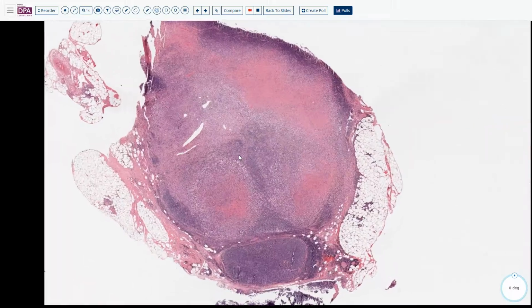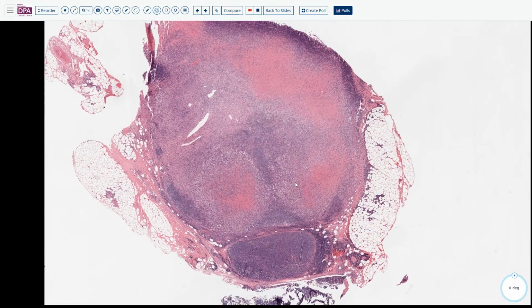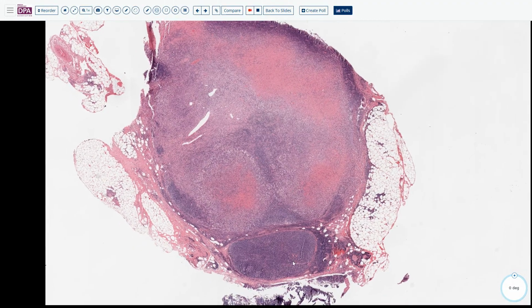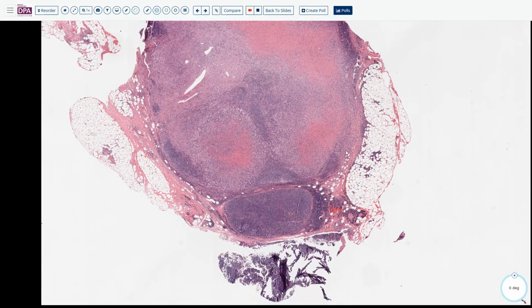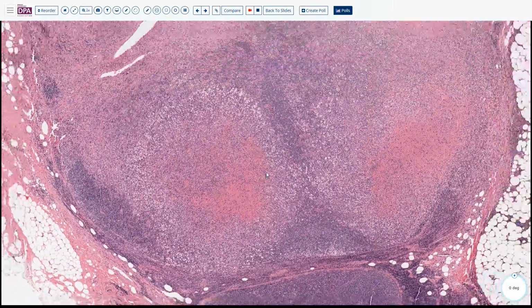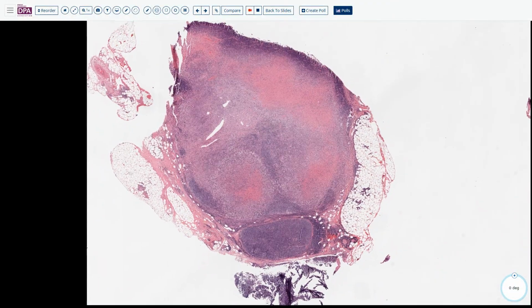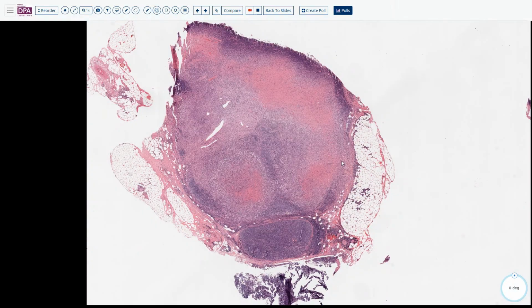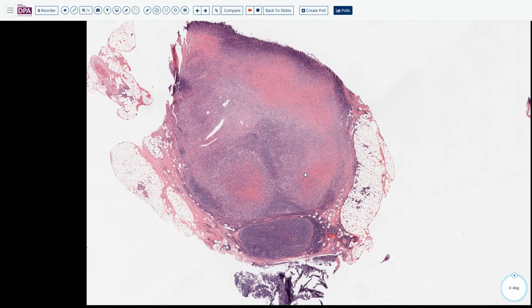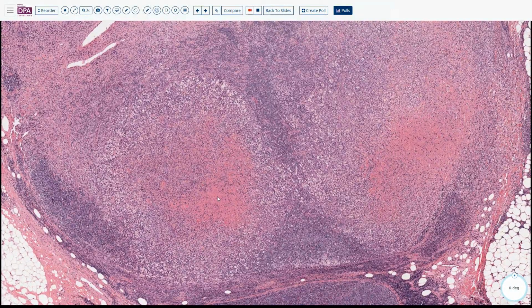And I will go through this one because this one is kind of difficult. We do not even recognize this as a true lymph node, but we can see it looks like something encapsulated. But the feature of this is that you should usually still recognize some germinal center or other lymph node area, not like this one, almost totally effaced. But in this area, we also can see this pink material that is the necrotic area.